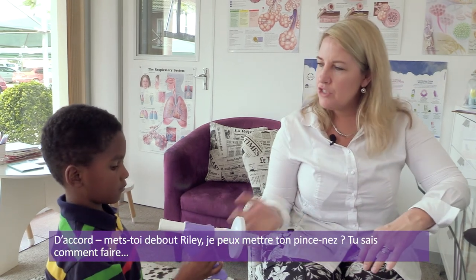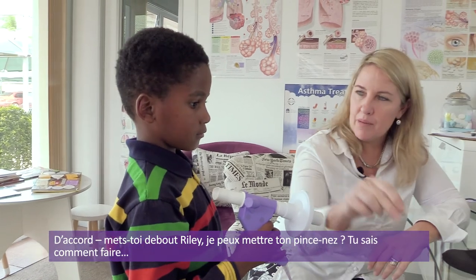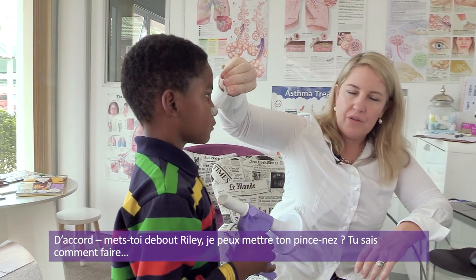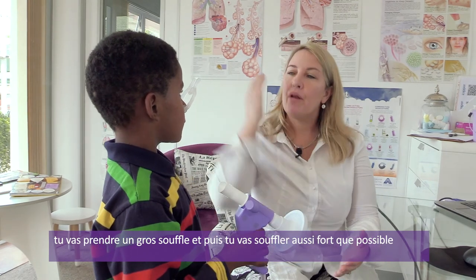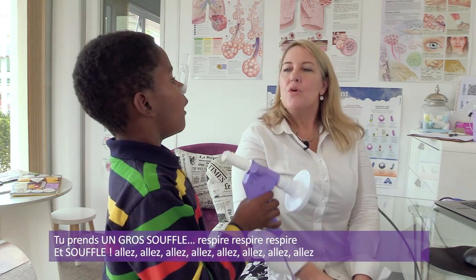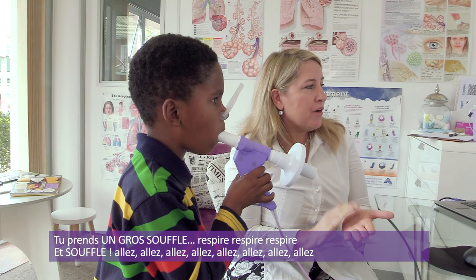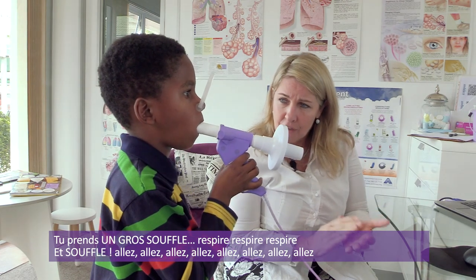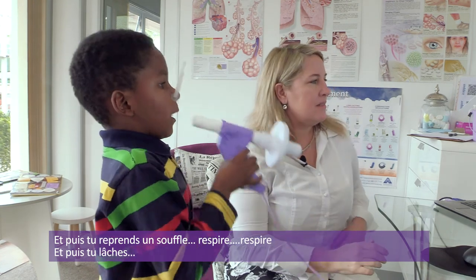Okay, so what I want you to do, please, is stand up, Riley. Can I put your nose clips on your nose for you? All right, so you know what to do, hey? You're going to take your biggest breath in and you're going to blast the air out as fast as you can. All right, take a deep breath in. In your mouth and go. And breathe in, breathe in, and relax. Very good.